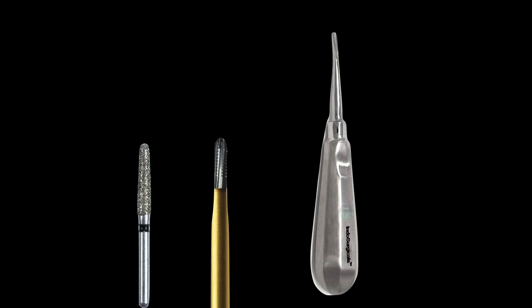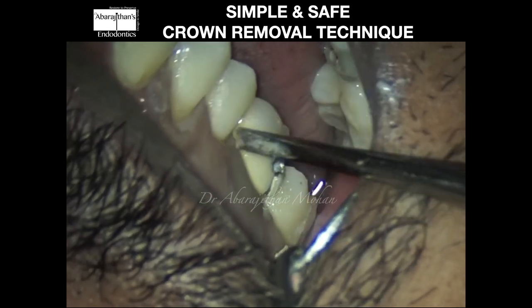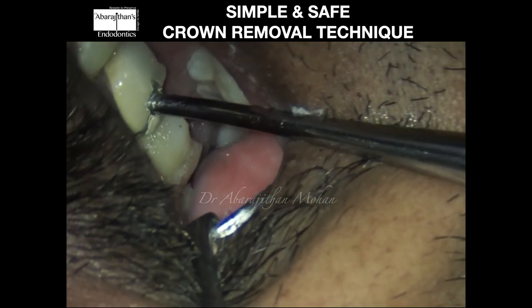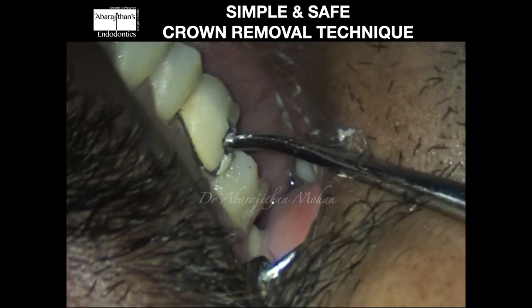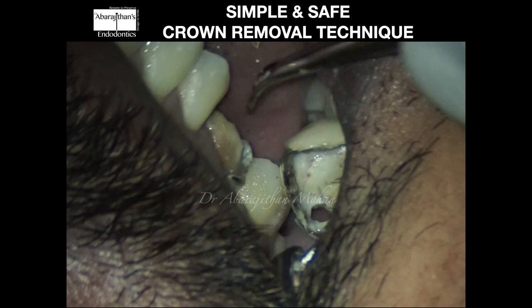You can see here — after making a hole on the buccal aspect of the crown almost in the cervical area, all I'm going to do is place my coupland elevator into the keyhole that I prepared and give gentle clockwise and anti-clockwise rotation, which is disengaging the crown from the underlying cement. And the crown is removed safely.